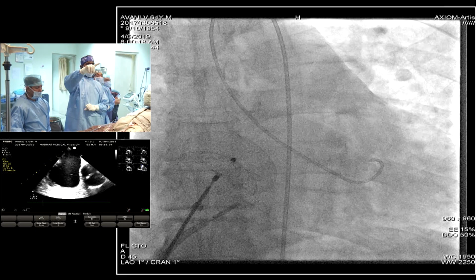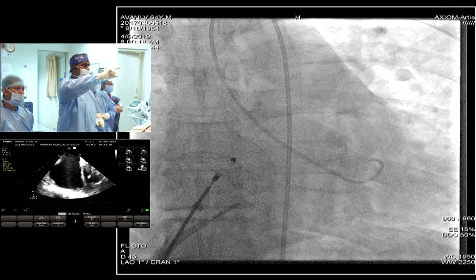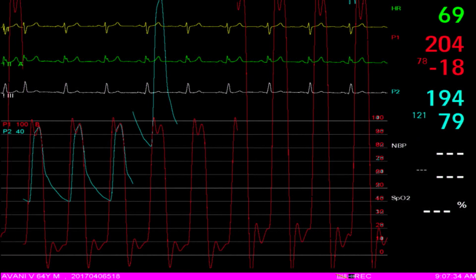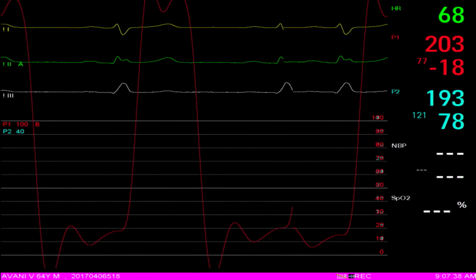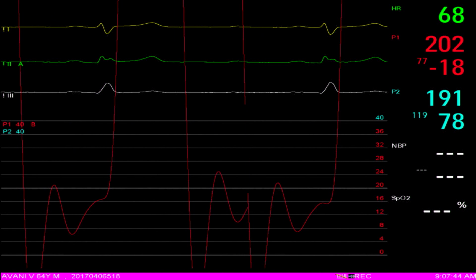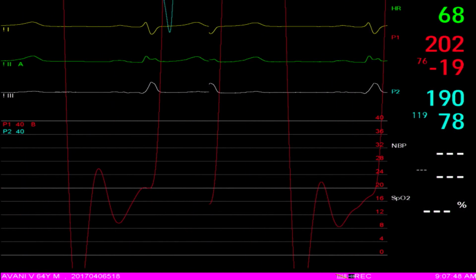But yeah, can you show the hemodynamics live now? Take away our pictures. Show the hemodynamics live. Yeah, so this is the left ventricular end-diastolic pressure. It's somewhere around 16. Make it in 20 scales. So when do you decide to pull off the device? What pressure measurements would it be?